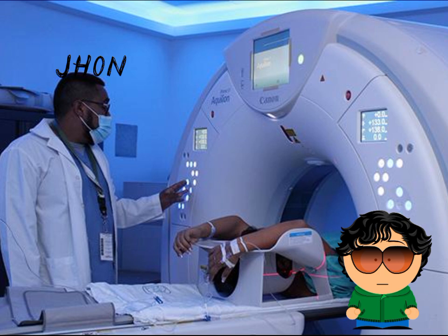Optical tomography uses infrared light to obtain images of tissues, often used in ophthalmology. Magnetic resonance imaging (MRI), although not always called tomography, some MRI modalities produce similar section images using magnetic fields and radio waves.